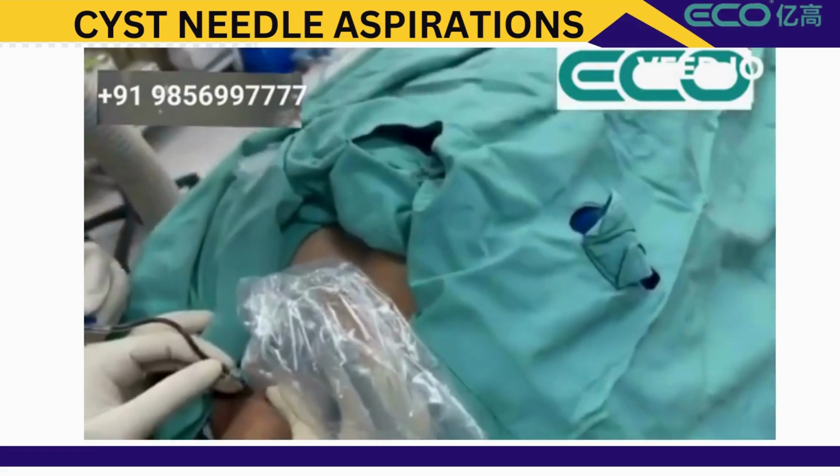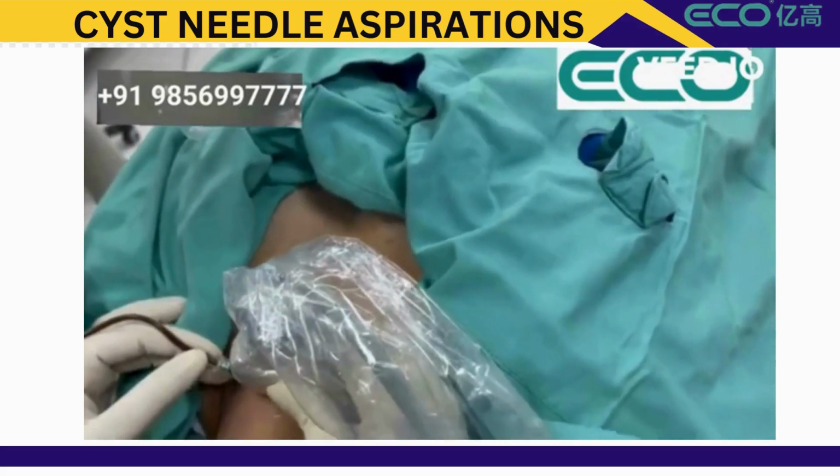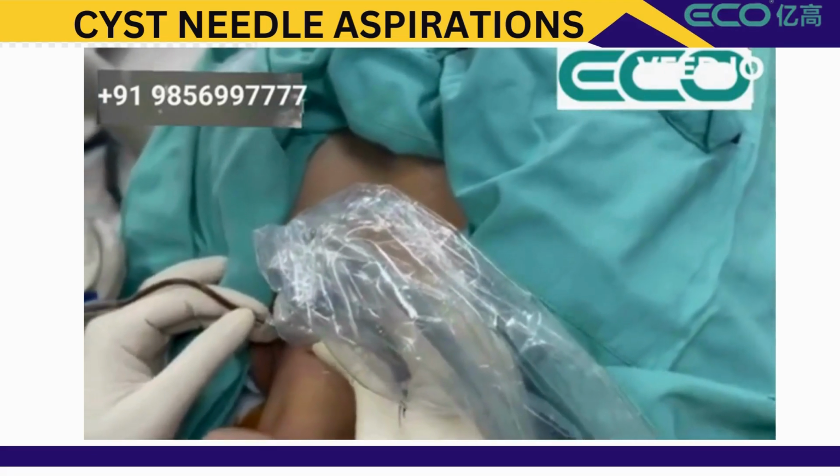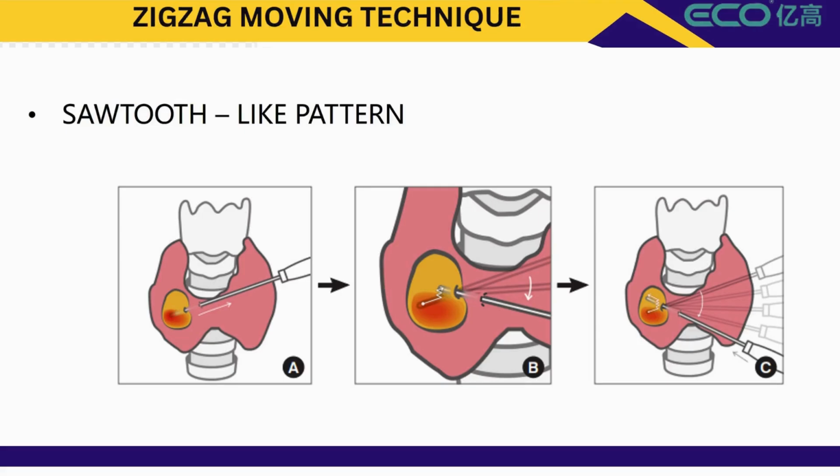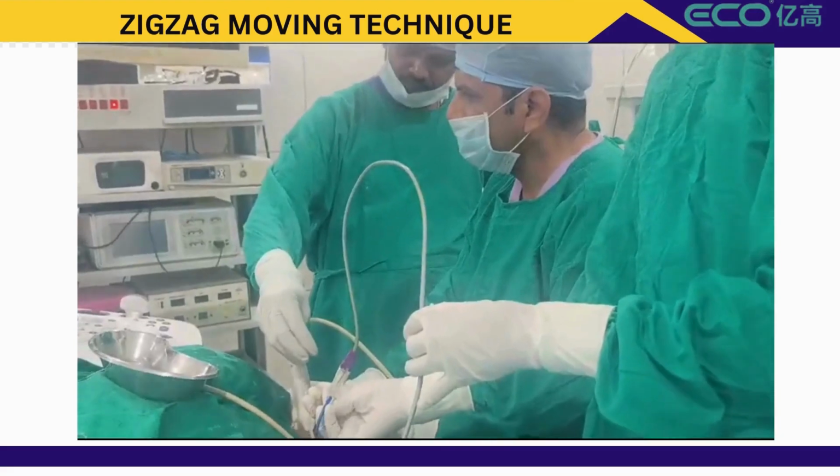You see this, there is colloid material coming. We are aspirating the cystic part. After aspiration, you can plan an advanced technique called the zigzag moving shot technique, from the inferior border to the superior, layer by layer, slicing layer.